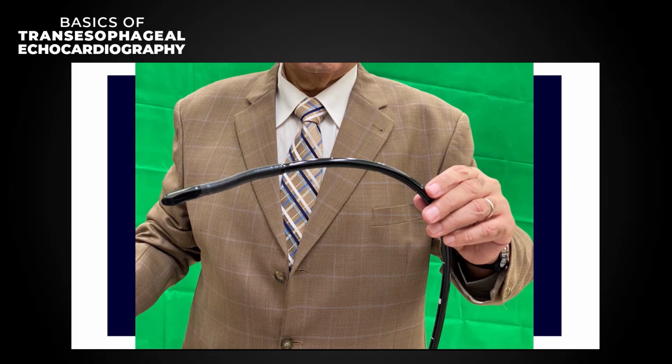How to differentiate pannus from thrombus in prosthetic mitral valve dysfunction? It's a very good question. Yes, actually, a pannus can be differentiated from a thrombus by 3D transesophageal echo. We can see the classic fibrosis which is present, and the pannus formation is present in the prosthetic valves by doing a 3D TEE.